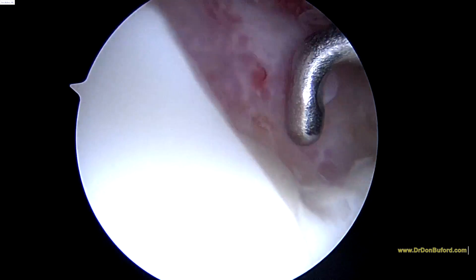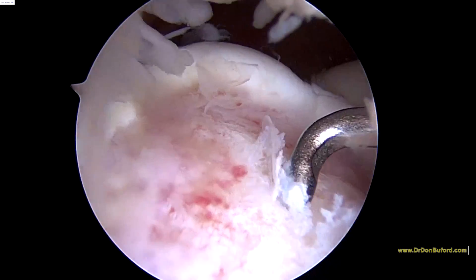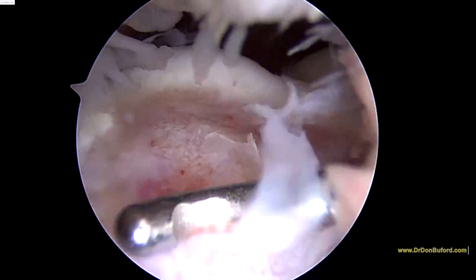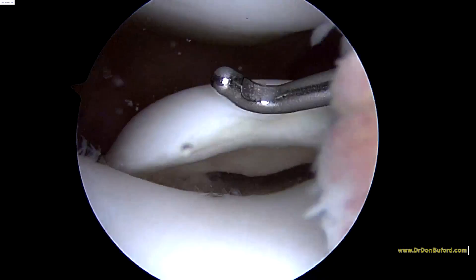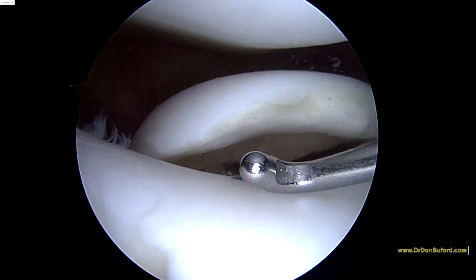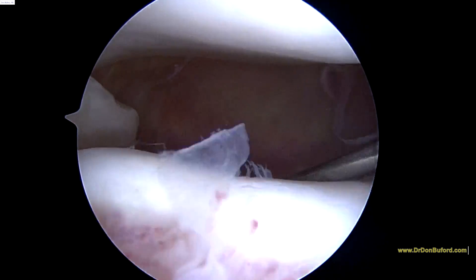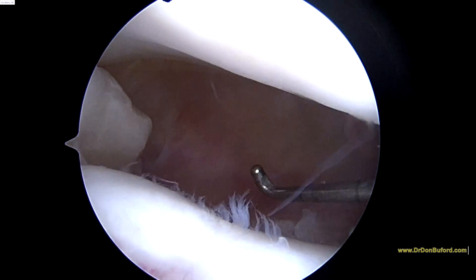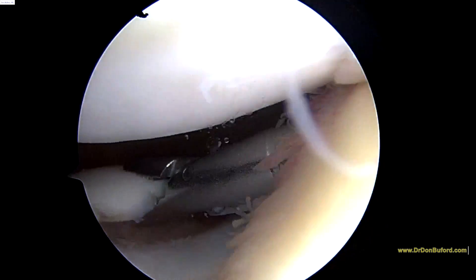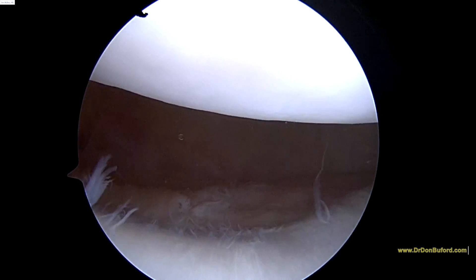That's four millimeters by about five or six millimeters. And there's the piece. The reason you can't just stick that piece back down is because it's completely detached and it doesn't have a blood supply. So we'll get to work on that in just a minute. Here you can see I've got a hold of the piece, and now we'll see if we can't remove that — and it's gone.